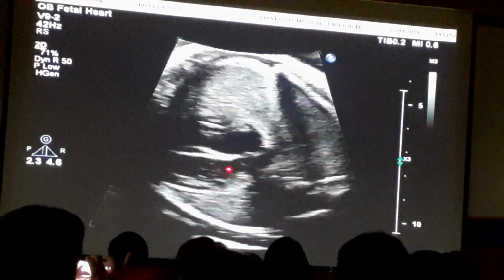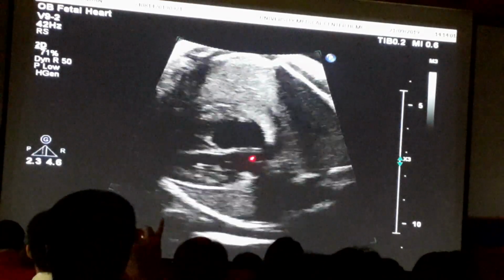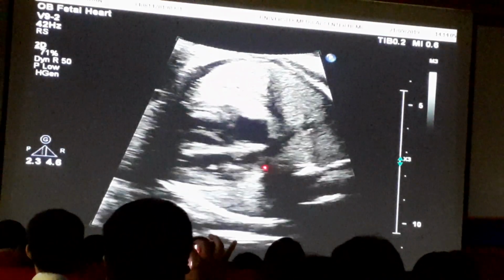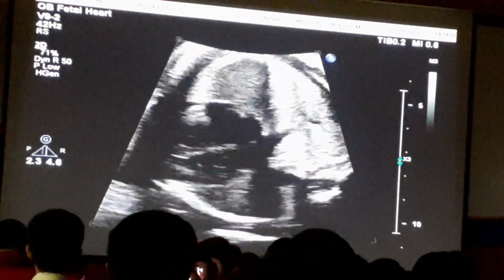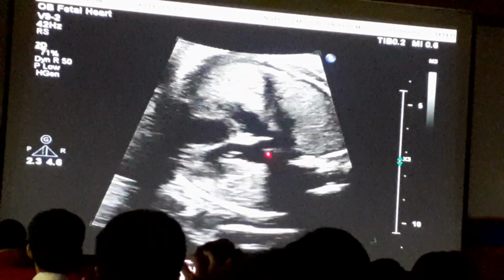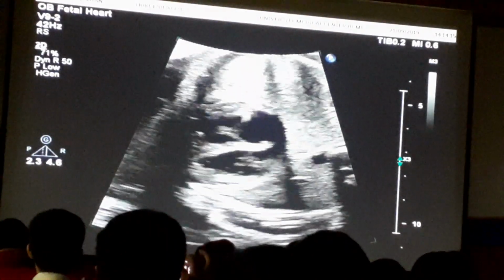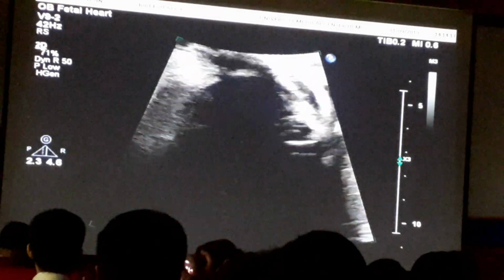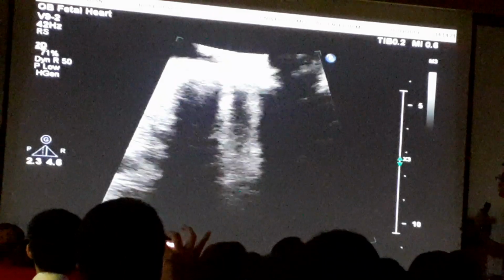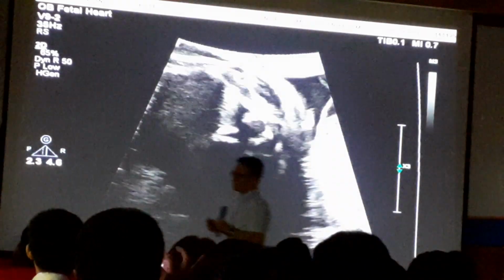Right, so as I'm trying to come up to the left ventricular outflow tract, the most posterior vessel coming off of the left ventricle is bifurcating, so that's a pulmonary artery. Bạn thấy con chim nó há miệng như hôm qua. Chim nhỏ. Chim lớn nó xuống vậy rồi. Chim quân bình này.